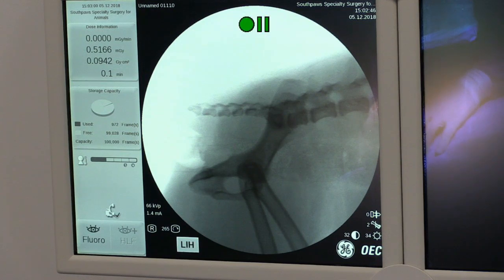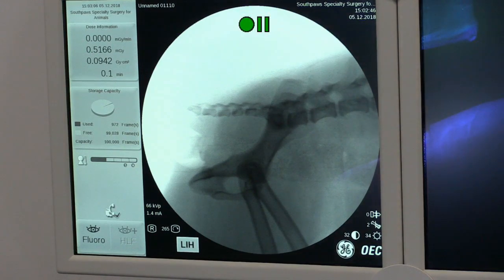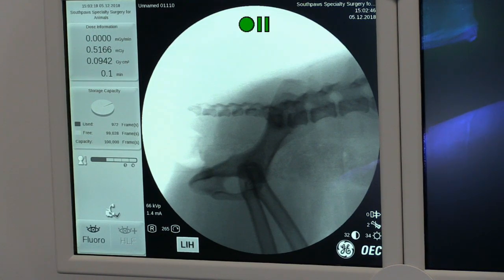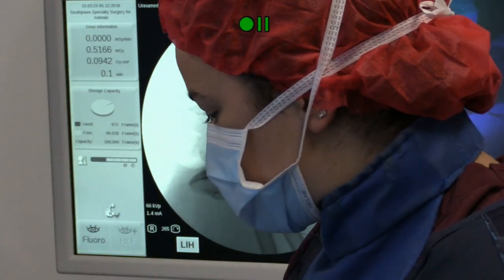Do you want the fluoro gantry higher? Yeah, maybe a little bit higher. You have to raise that. Sorry, the fluoro gantry. Oh, the actual fluoro head. Just so he has more room.